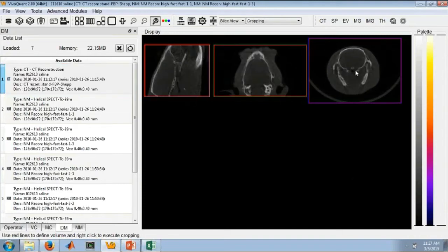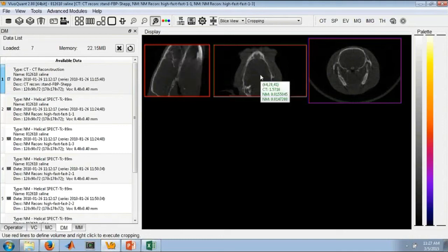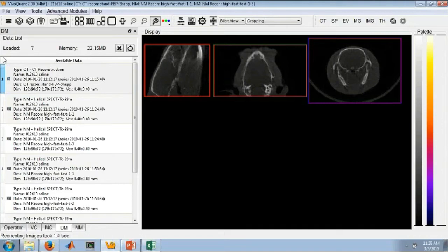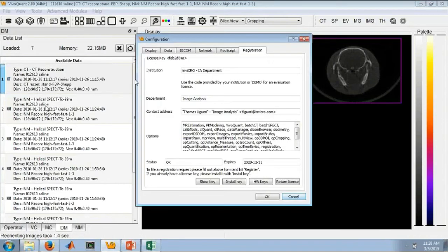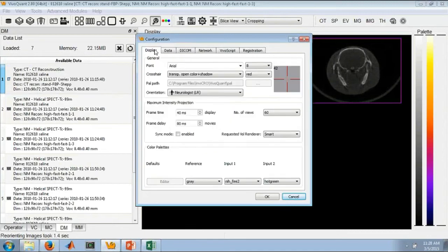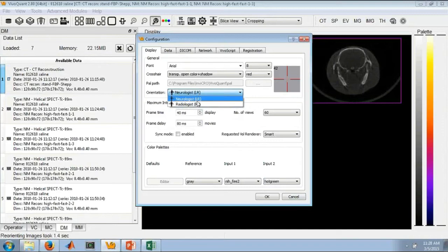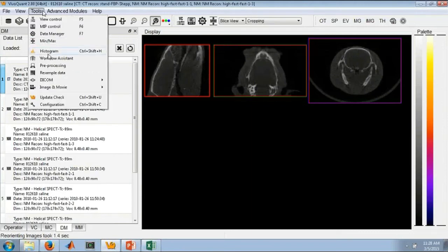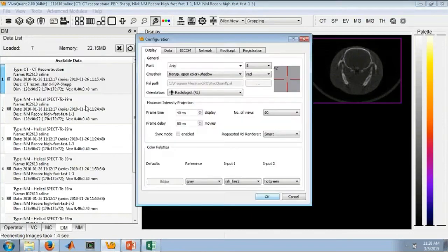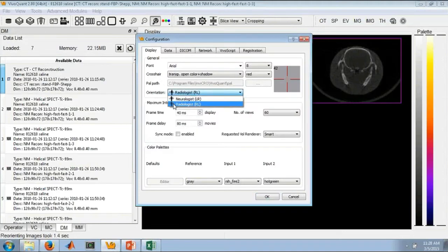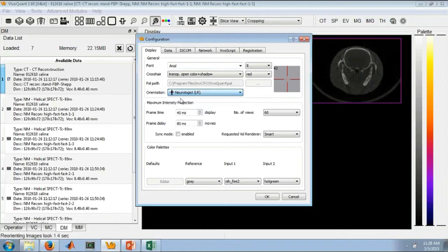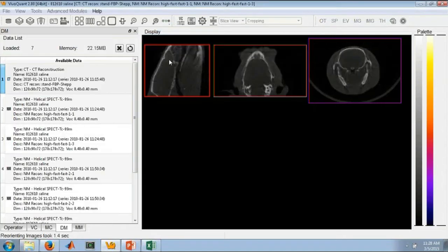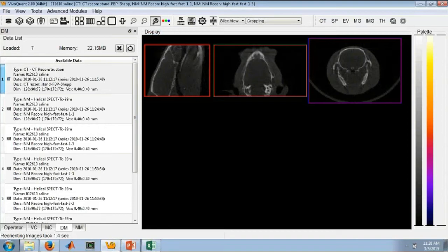Also, not particularly interesting for the preclinical space, but for anyone doing any clinical work, one other tool that we have added is the ability to switch back and forth between what we call the neurologist view and the radiologist view. As many of you may know, a radiologist traditionally will look at data such as you would face a patient. If you see the image here, it appears as though the heart is on your right as opposed to our traditional way of viewing data, which is the neurologist view, which is that you're looking more at data in a mirror or from behind a patient. That's just how you can quickly switch back and forth between those two views.